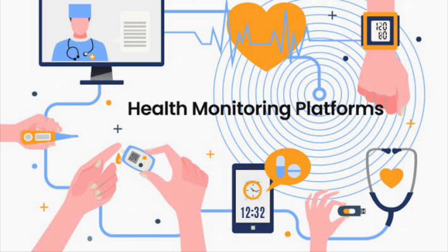Right from wearable technologies which can monitor many vital signs like oxygen saturation, the cardiac rhythm, the respiratory rate, the body temperature, the physiological status, whether the patient is standing, walking or lying, to identify whether he has fallen down, and lastly the blood pressure. So this technology is evolving. For example, in an Apple Watch, everything except blood pressure can be recorded. And there are devices which are available now where glucose can be monitored continuously. This is something that is evolving every year, and this evolution of technology might happen for the next 1 or 2 years.